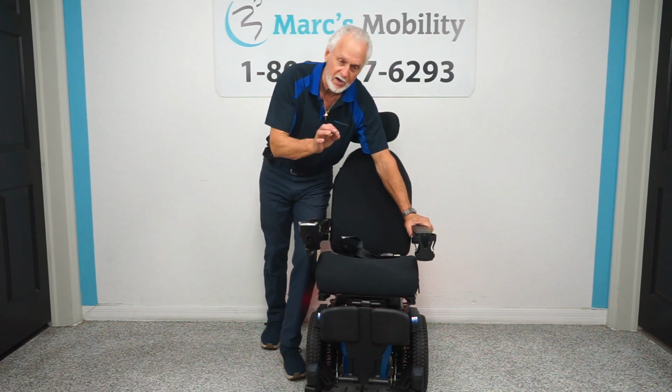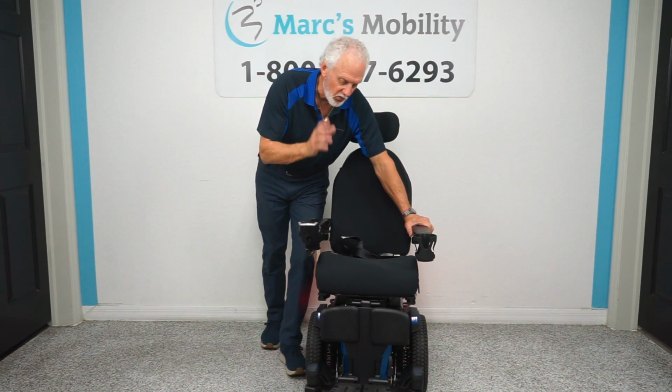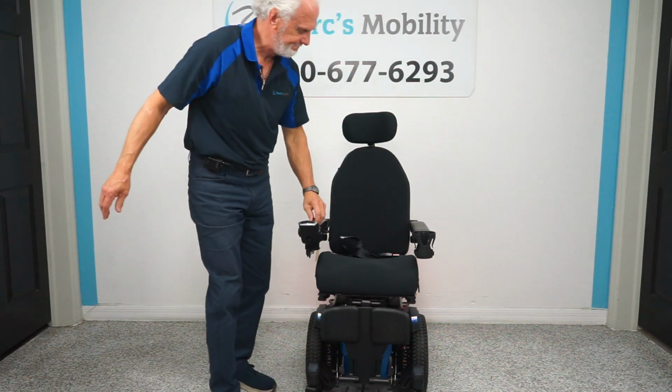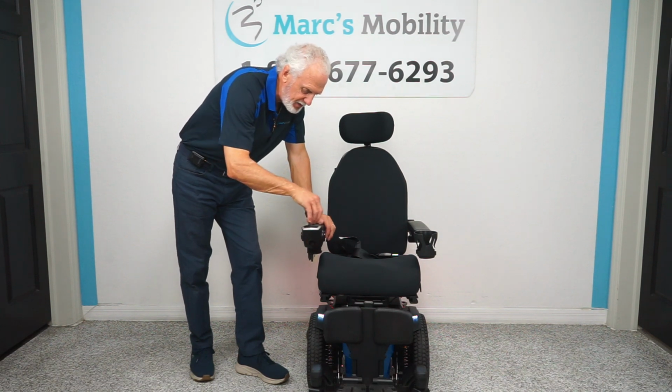So this is a Quantum Stretto. Stretto's Italian, I think it means smaller or small. The footplate does flip up when you exit the chair. We're going to put the footplates back out a little bit because we're going to go outside in a minute.